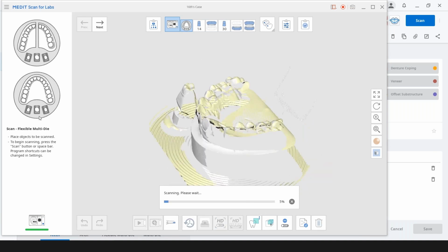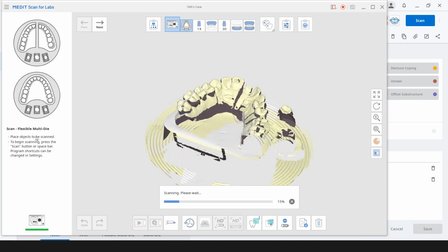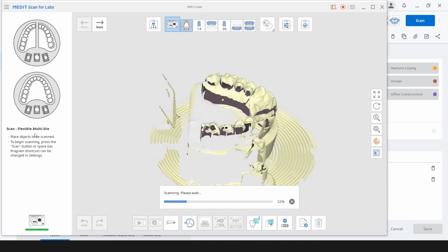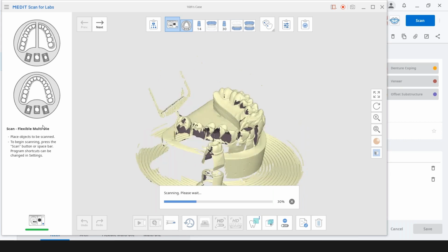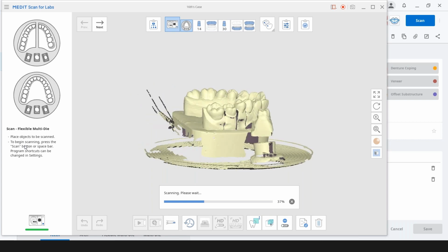Also on your left side, it always has some instruction over here, kind of like a wizard. It's not going to answer everything for you or give you every step, but it's kind of like a reminder: check this, do that, see what you've got.